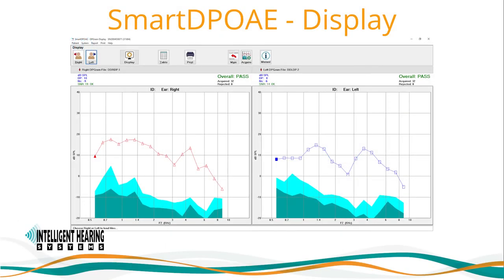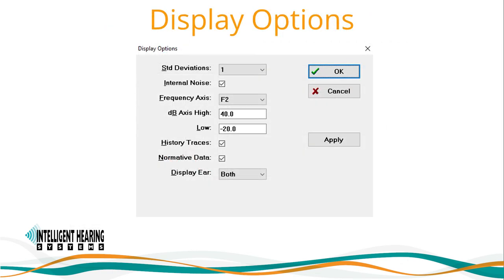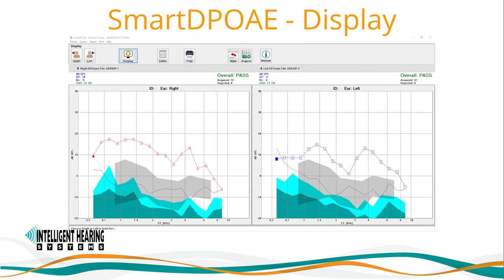You can display and print all recordings from the display page. Results are plotted on a DPgram with the frequency referenced at the F2 frequency, because F2 is the closest site of stimulation. You can adjust display options such as showing or hiding the standard deviation display, internal noise measurement, history traces, and/or normative data. You can also change your frequency and dB axis.